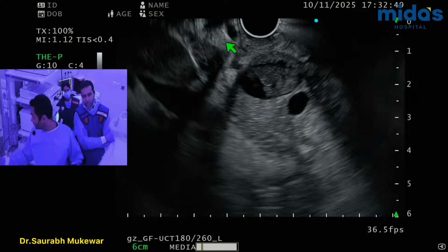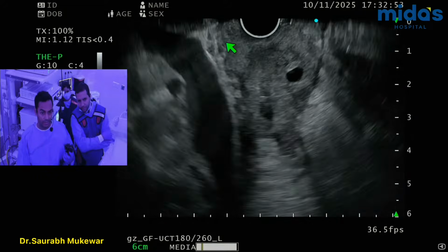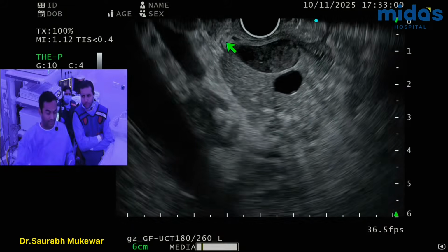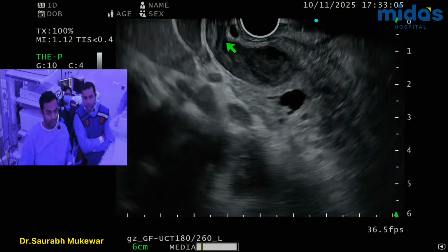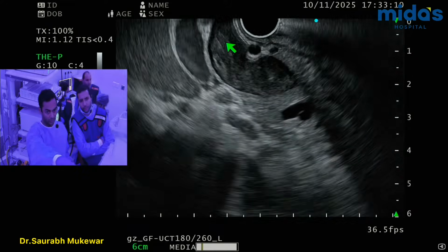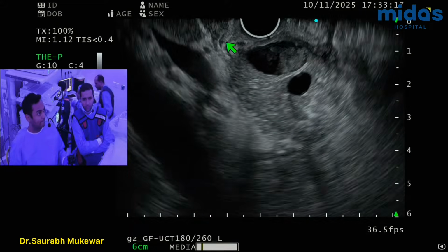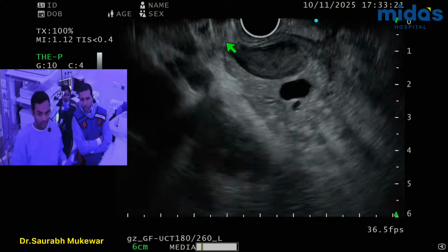Yeah, Snehal? All right, so this is the intra-pancreatic portion of the bile duct. Come up here. So I think this is a good area to hit, but the problem is going to be, unless I really position the stent till where that artery is almost. And then it's okay. I mean, I'm going through the intrapancreatic portion. Spot fluoro. Yeah, but still the wire can be a little bit of a task to go across.